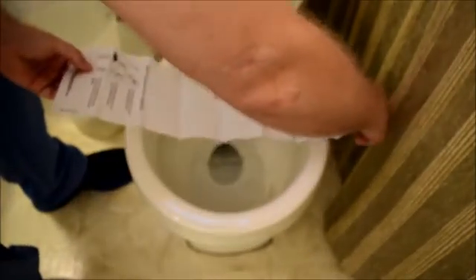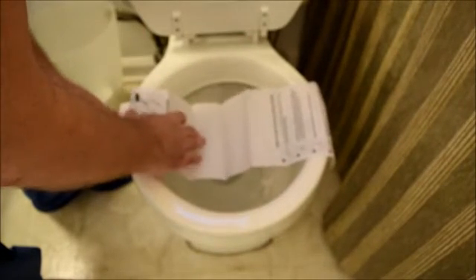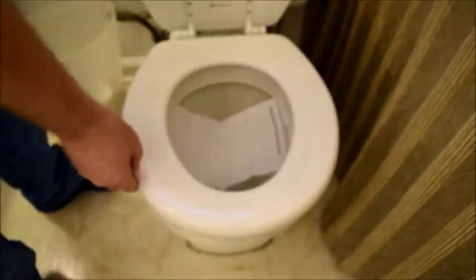And you're going to make a bridge across your toilet bowl with the tissue paper. Please make sure while doing so that you leave enough slack for the sample to remain between the tissue paper and yourself, like so. Now you may lower the toilet seat. Now you can go ahead and use the restroom, depositing the sample onto the tissue paper. Please make sure you do not urinate onto the paper and the sample.